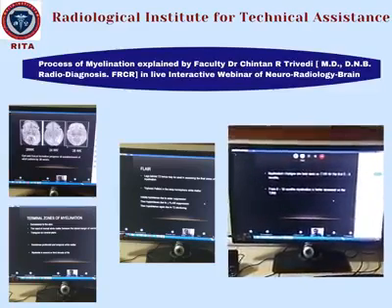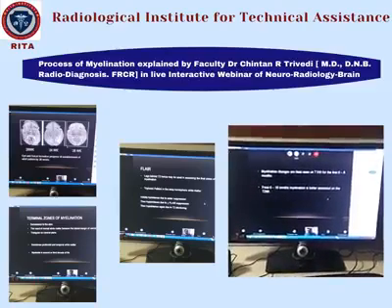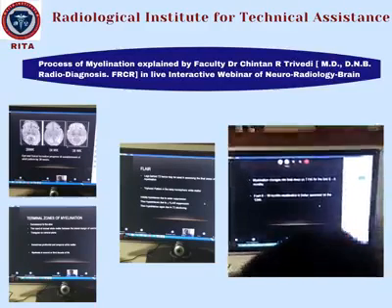And the regular subcortical white matter and all, they show it better on the T2. So from 6 to 18 months of age, the myelination will be better assessed on a T2.